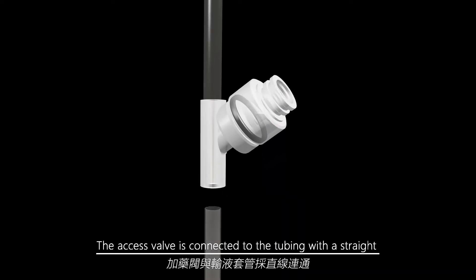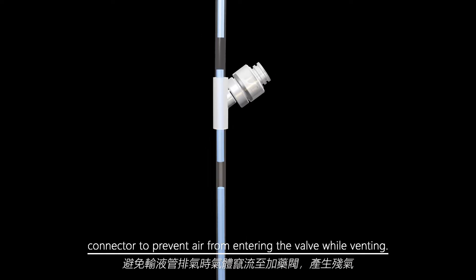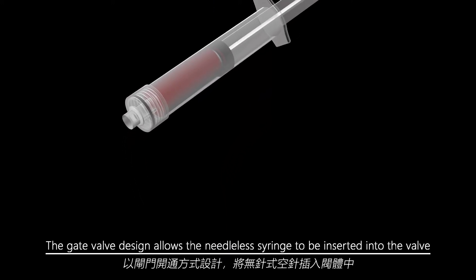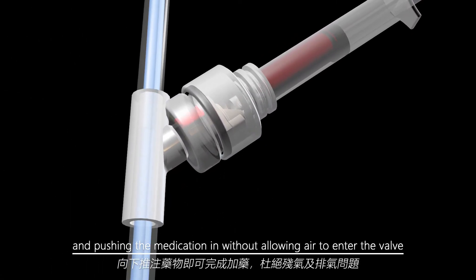The access valve is connected to the tubing with a straight connector to prevent air from entering the valve while venting. The gate valve design allows the needleless syringe to be inserted into the valve, forcing it to open to the left with the internally sloped head, and pushing the medication in without allowing air to enter the valve.